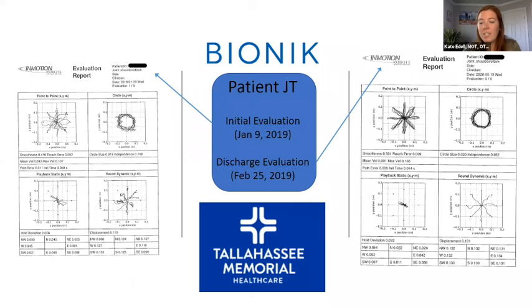Okay. Sheree, do you have any comments on other strategies for dosage, or maybe what other settings might use? Sure. So in the acute inpatient rehab world, many times there are so many things that people have to work on that getting enough time on the robot can be difficult because, again, as we all know, there's pressure on everybody to get people out of the hospital as fast as possible. So we do have clinics that tend to use it for 20, 30 minutes at a time and then follow it with an activity, particularly.